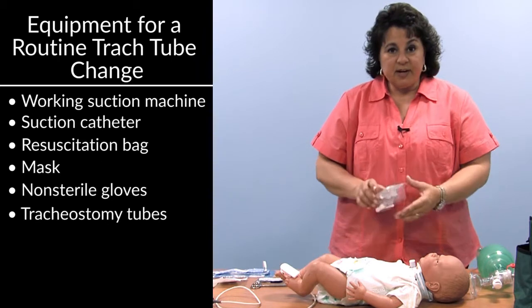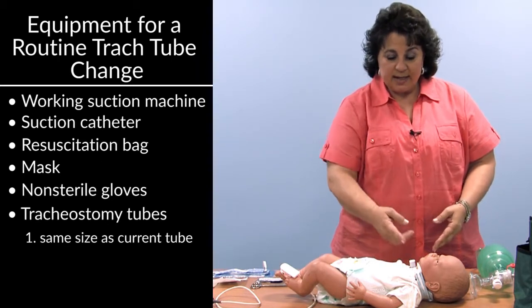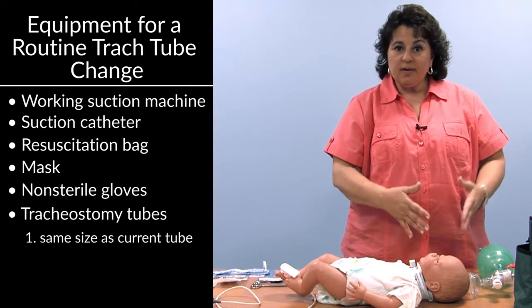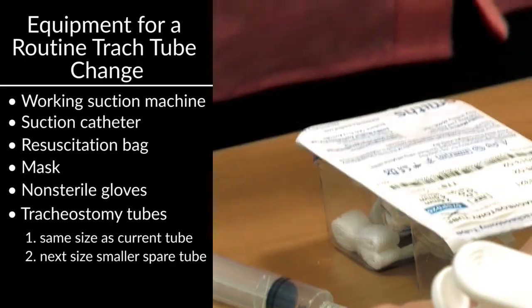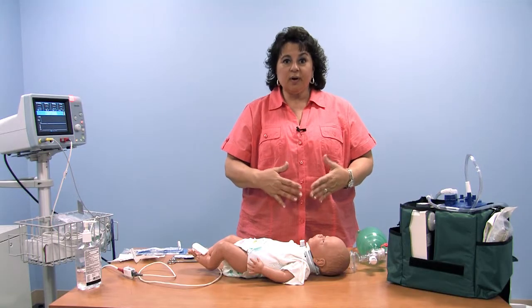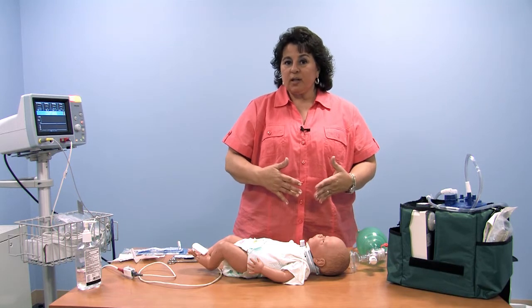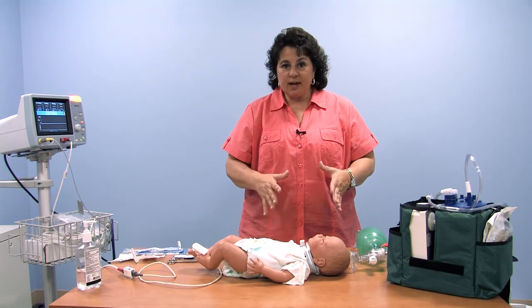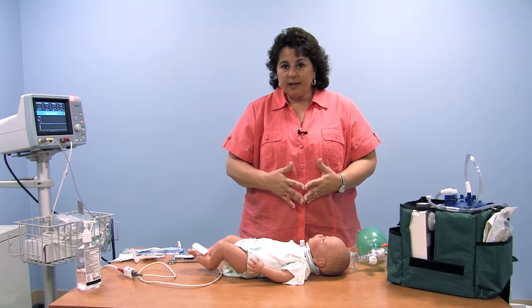We will have our tracheostomy tube that is the same size the child has in place right now, and we will also have a backup spare tube of a size smaller in the event that we cannot get this tube in. Talk to your physician, your respiratory care practitioner, and your durable medical equipment company about what tubes you should have available for your child based on the tube that they have in their body.